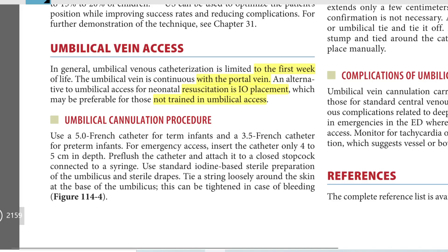Umbilical cannulation procedure. We use a 5 French catheter for term infants and a 3.5 French catheter for preterm infants.